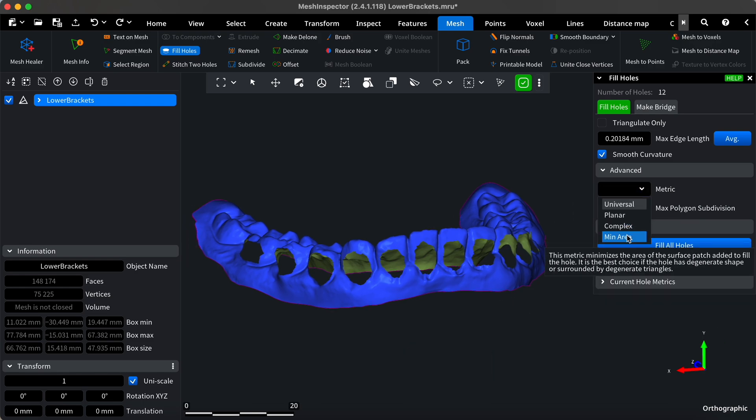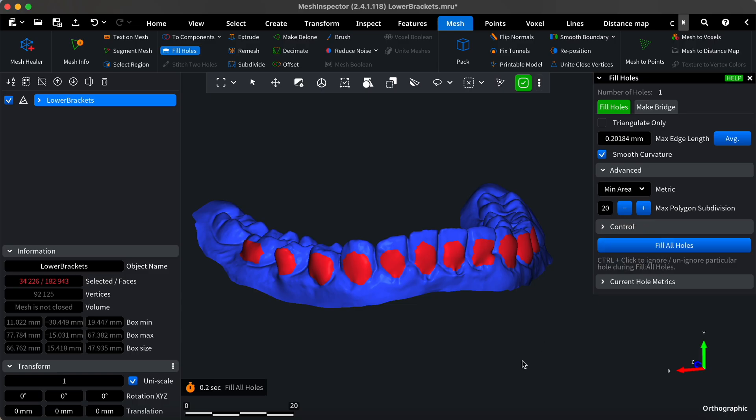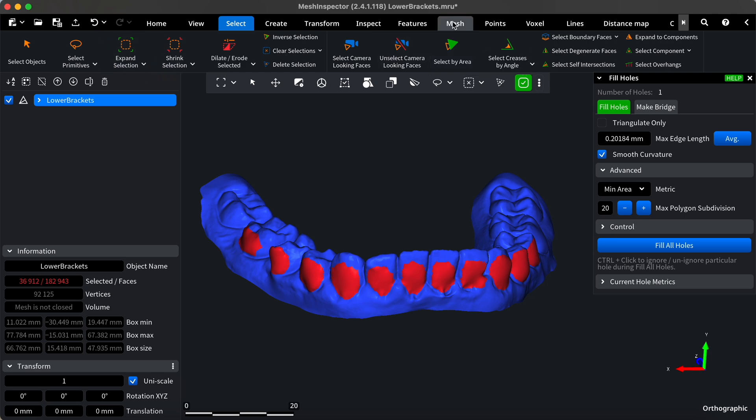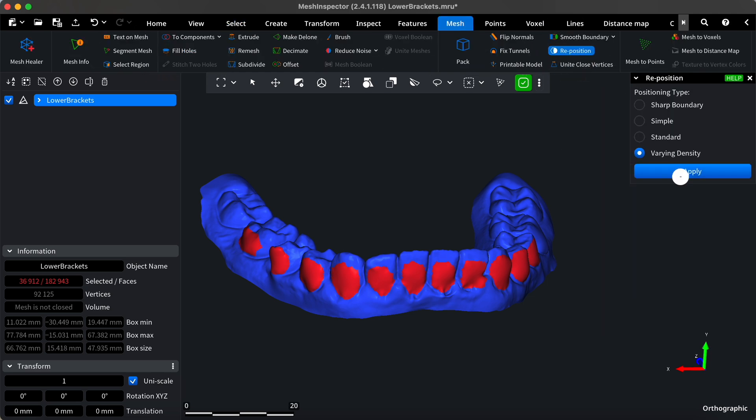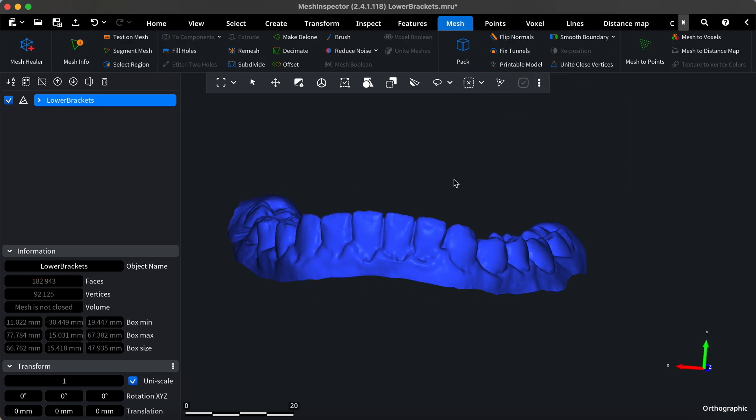Then, press apply and repeat the process as shown earlier on the single tooth. Here we go! We've achieved a good result!